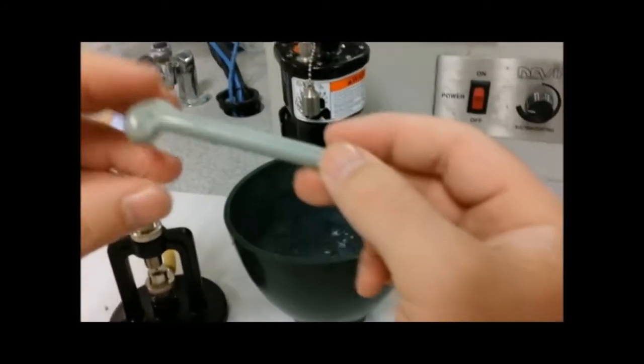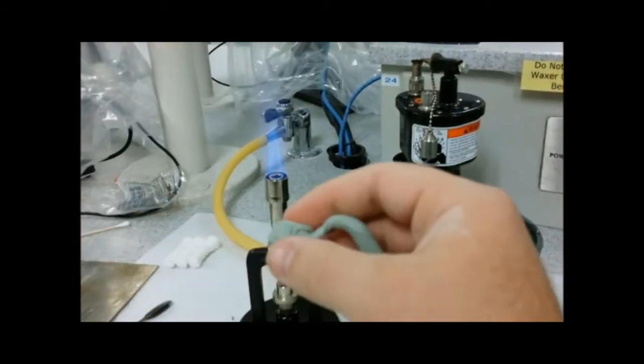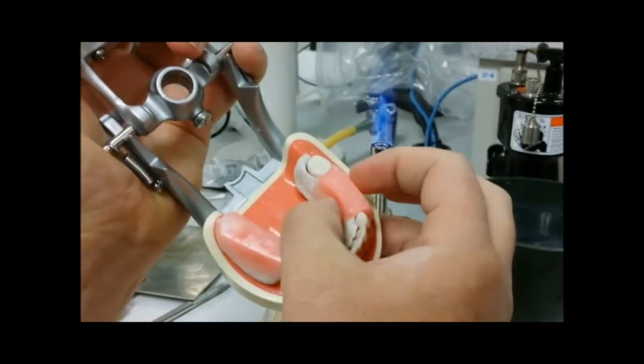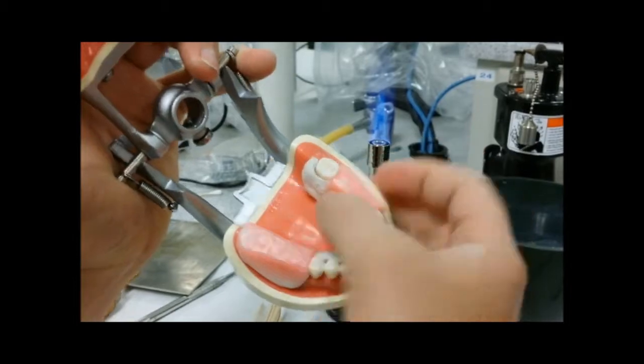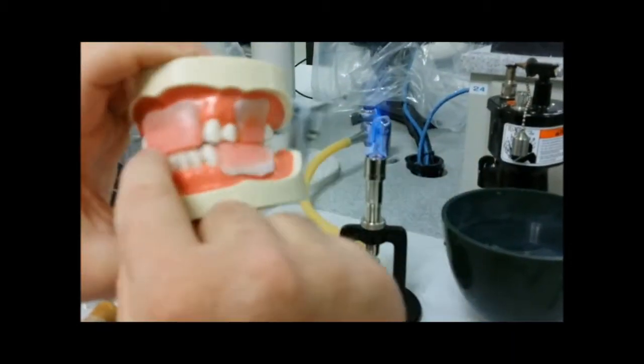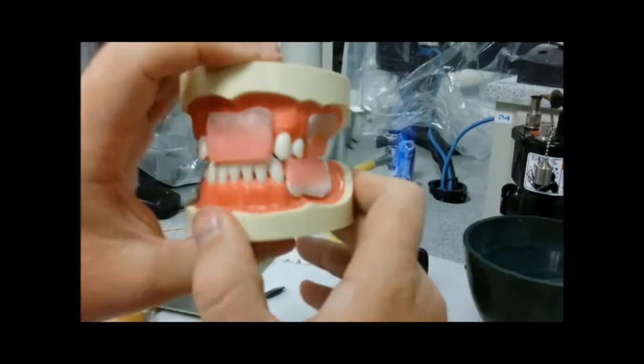And once it starts getting soft like that, dip it in the water and then you can actually touch it with your hands and shape it on your occlusion once you take all this down. Be able to shape it on their wax and get it ready to put it in your patient's mouth, close them down and they'll bite and take an actual registration of their occlusion so you'll be able to mount an accurate case.